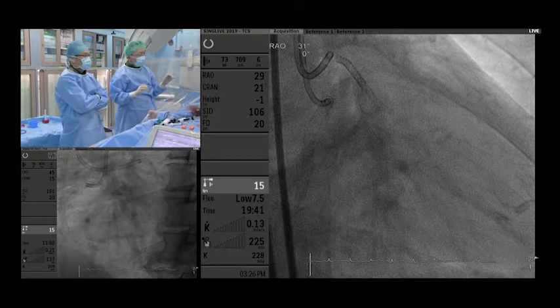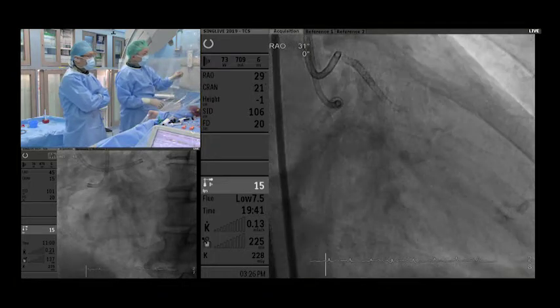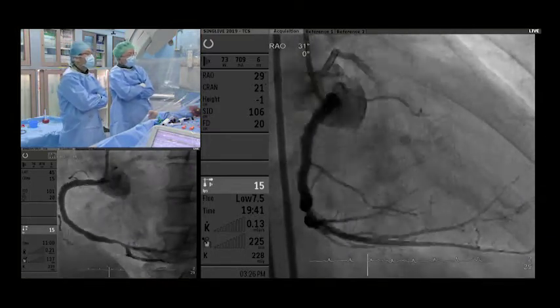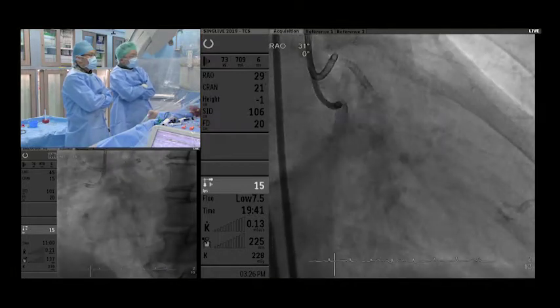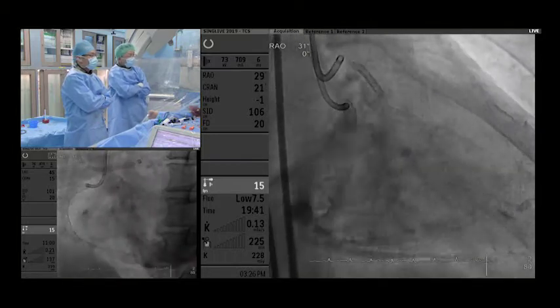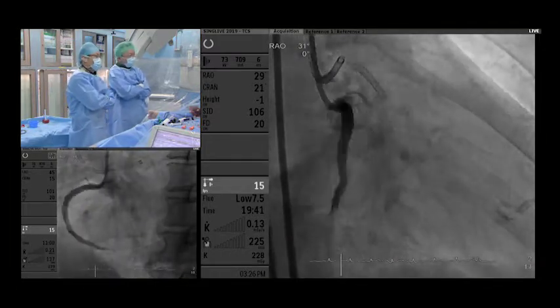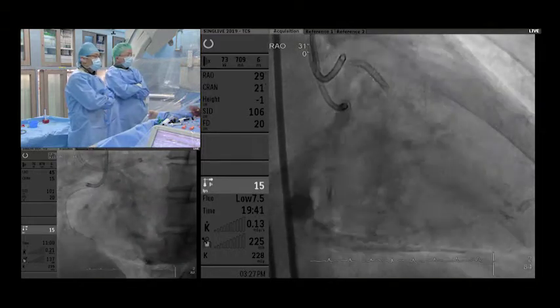So, according to the previous angiogram, the distal end of the proximal-to-distal LAD mainly receives collateral through a separated conus branch. So we should keep this in our mind. So this is today's first shot. I put two 8 French long sheaths, and I put an 8 French XB35 side hole into the left coronary, and this is just a 7 French internal mammary side hole into the RCA. And the findings are quite different from immediately after PCI. After several weeks, the PDA developed some nice collaterals to the distal LAD.